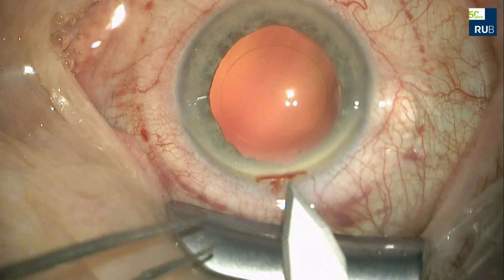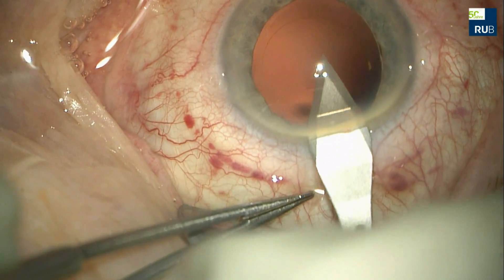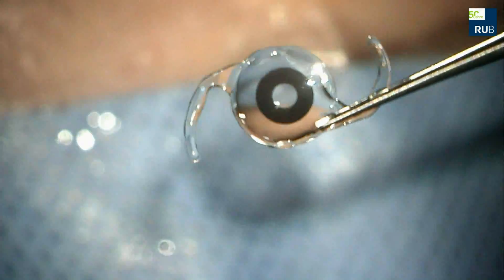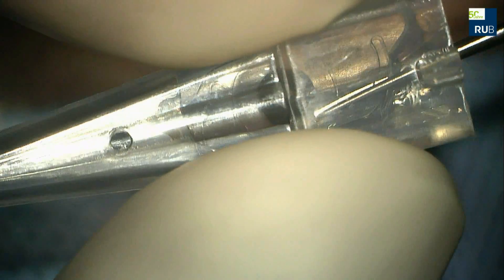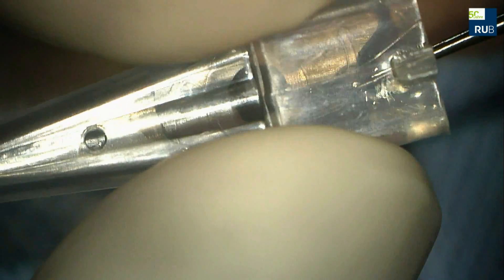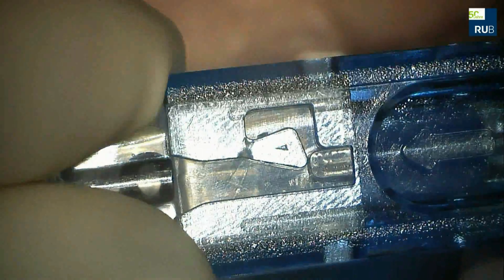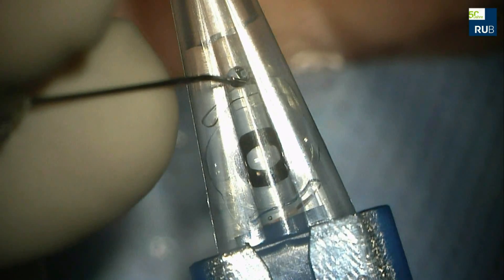A 3.5mm keratome is used to enlarge the incision for insertion of the IC8 intraocular lens. The IOL is removed from a holder and placed into the cartridge, which has been filled with viscoelastic. It is then placed into the inserter and locked into place. Using the plunger, the lens is advanced forward to the stopping point using the cannula from the OVD syringe until the inserter clicks.